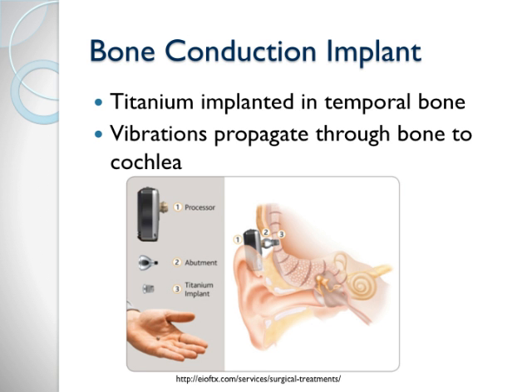from our voice box to our cochleas, which is a natural and internal auxiliary path to our cochleas. As shown in the figure, bone conduction treatment involves a titanium implant inserted into the temporal bone near the ear. The mechanical vibrations replicating those frequencies captured in the air propagate from this implant through the temporal bone to the cochlea where it is stimulated. An advantage over other hearing aid techniques is that the sound in the bone also propagates to the other ear's cochlea, slightly attenuated by the extra distance traveled, which results in the ability of sound localization.